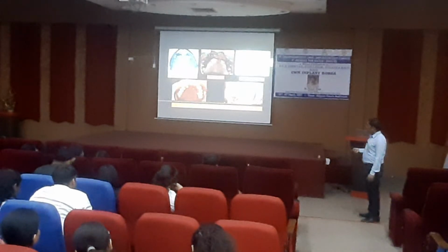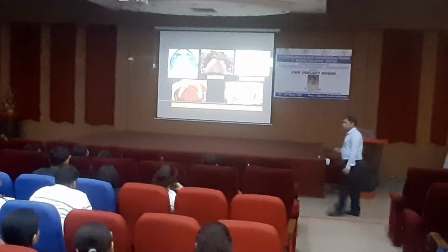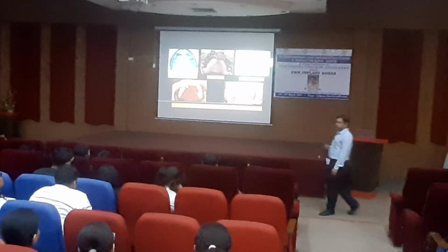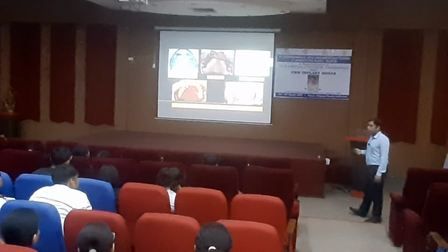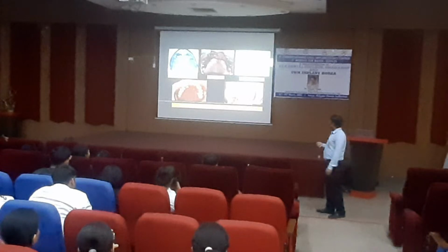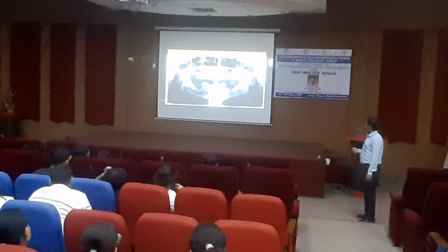If you see here, these screws are okay on the palatal side. This is also on the palatal side. So if the screw is palatal, it is better. If it comes on the buccal side, it is very difficult because of aesthetics, and also the forces are not going in the axial direction of the tooth. Okay, this is the prosthesis.